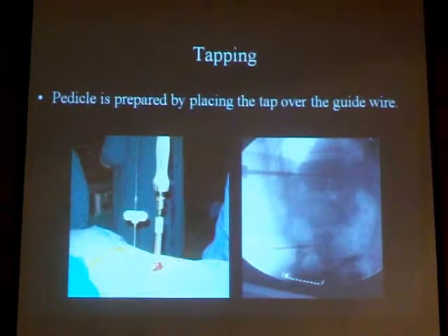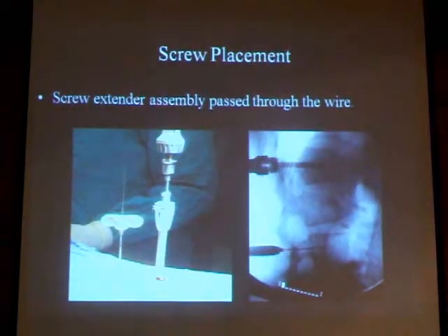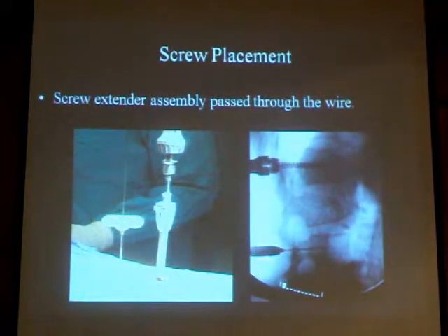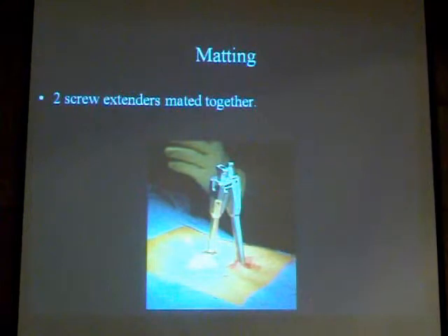We do tapping through this dilator, similar to open surgery. Then we start to insert the screw with its extender assembly. Once we place the screws one level above and one level below the fracture, we connect the screw extenders together so we can pass the rod through them.